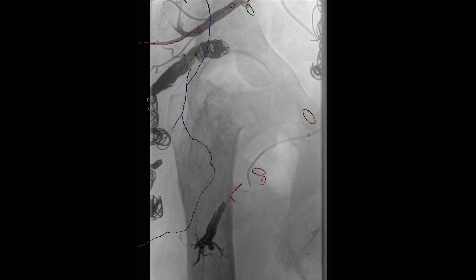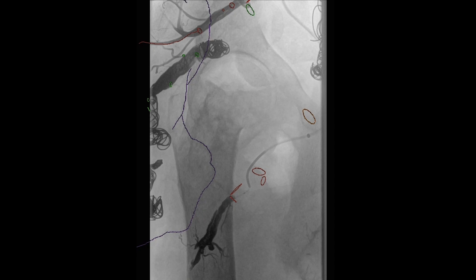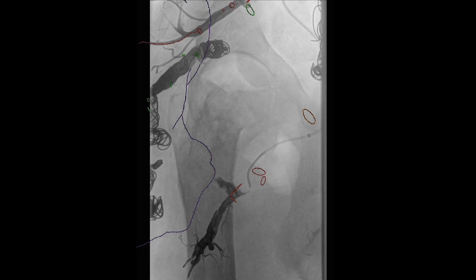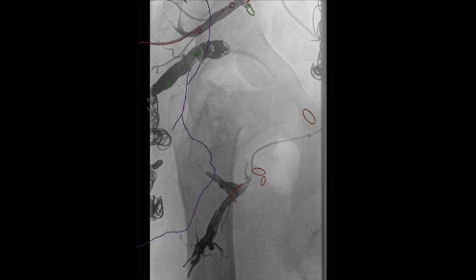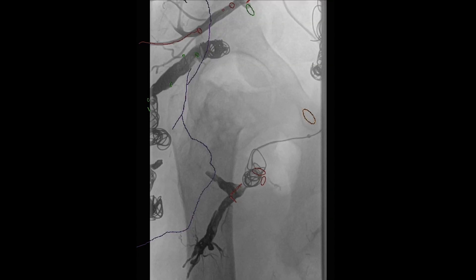As we come back into the aneurysmal component we switch over to coils, because coils do a better job when dealing with a large blood vessel. We continue injecting onyx and as we come back into the bigger component of the profunda, we remove the micro catheter and replace it with coils.